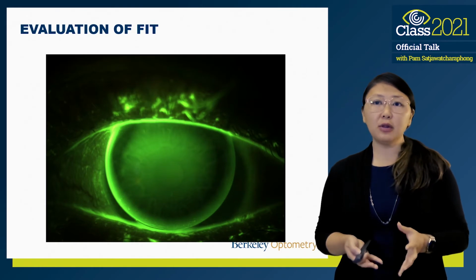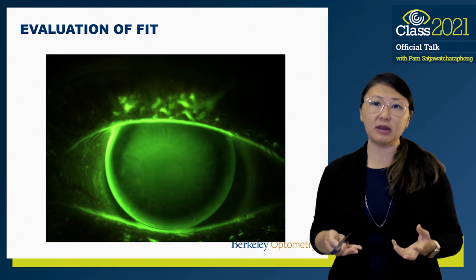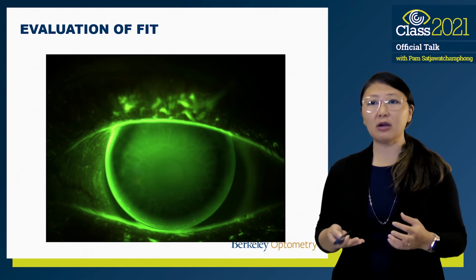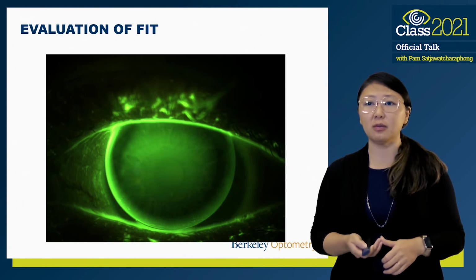So let's go through a couple of photos that describe evaluations of fit. Now this is a static photo, so we're not going to be describing movement, but it just gives you a better idea of how you would go about describing a fit. And then we'll go into some videos that show some movement.